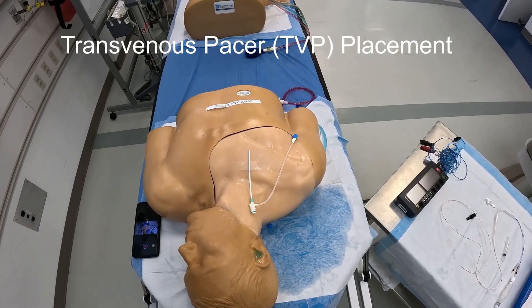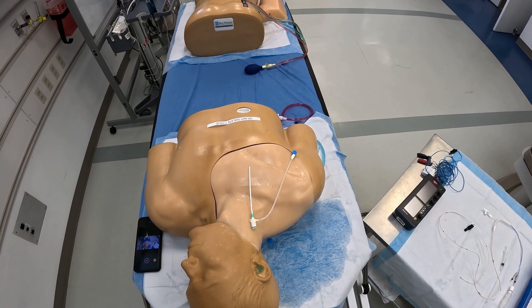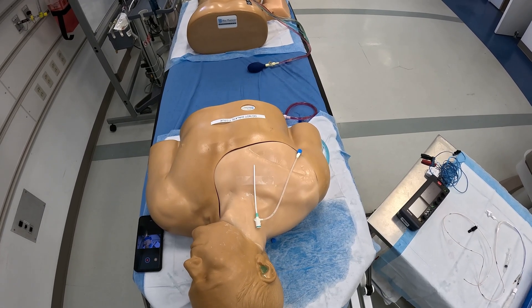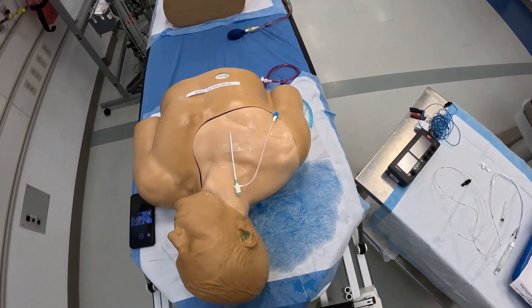Hey everyone, my name is Kevin. I'm part of the SIM department. Today we're going to be talking about the transvenous pacer as it applies to most of our NYU locations in terms of the box that we have.